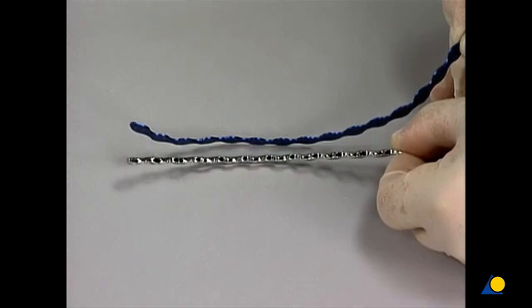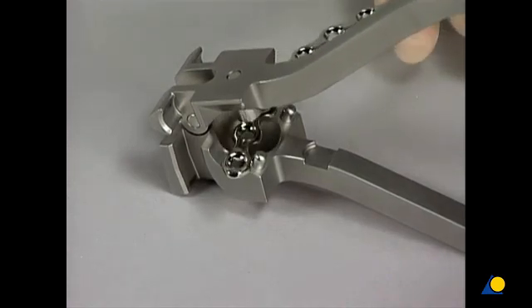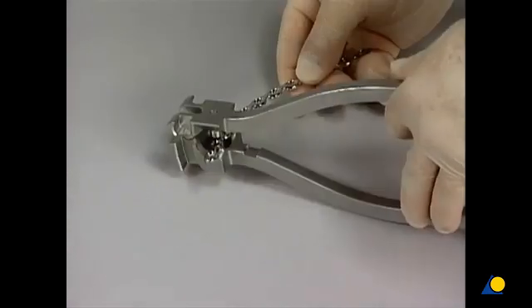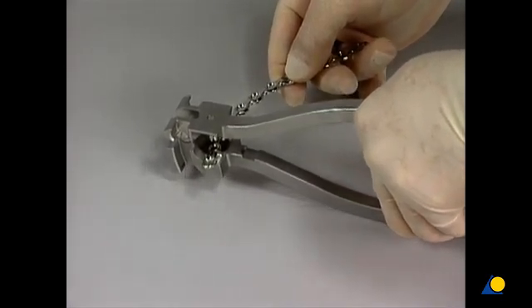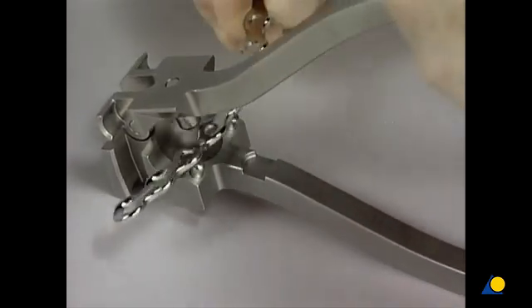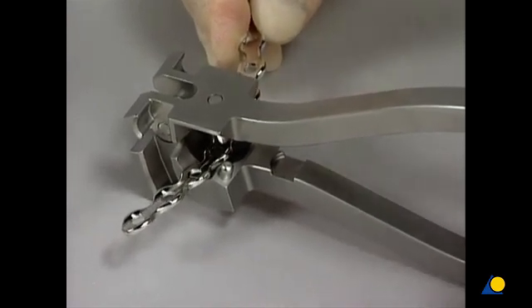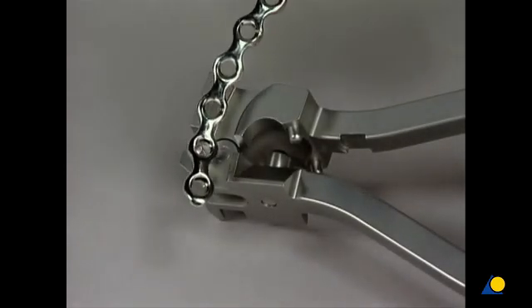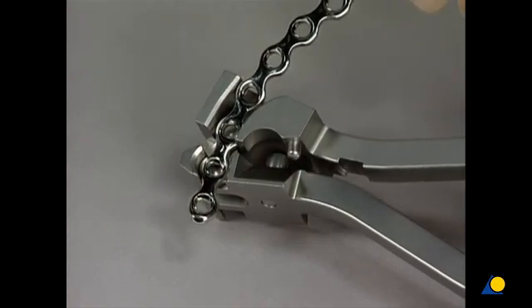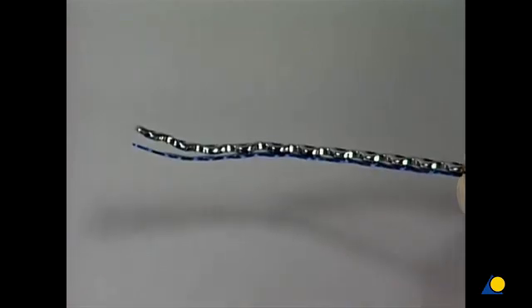As the primary purpose of this plate is to buttress the anterior column, posterior contouring is critical. First, the concave contouring is performed. The plate is then flipped and the convex contouring is made. The curvature of the plate is adjusted by bending along its longitudinal axis. After the plate has been contoured, its profile is checked against the template.